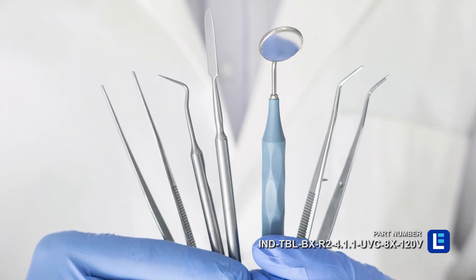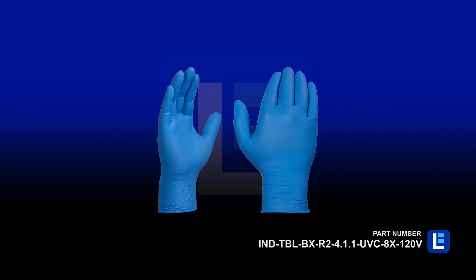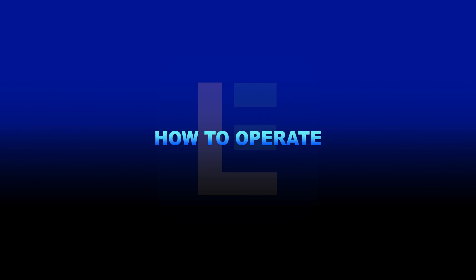The system can also be used to disinfect medical equipment including masks, face shields, gloves, ventilators, hoses, and more.